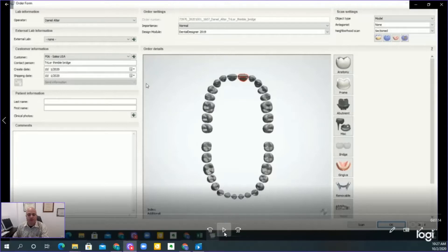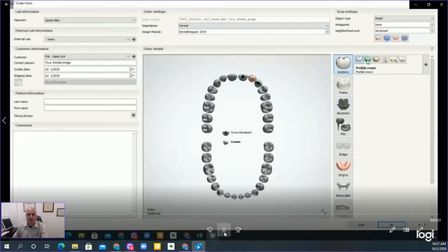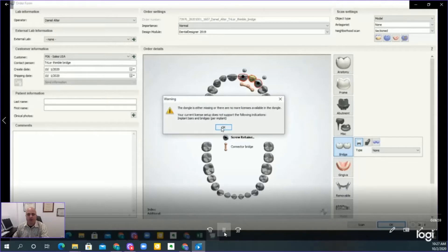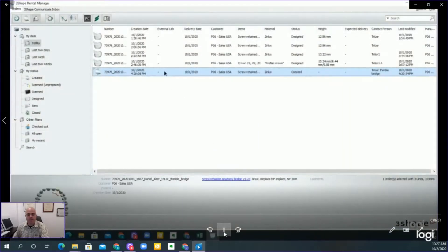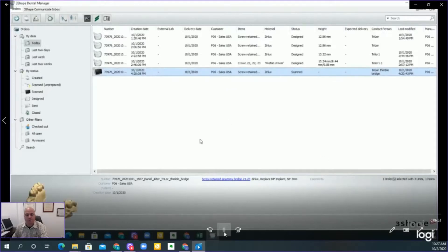There is now a Thimble library that you can import into your Three Shape. What you need to do is first create a full contour type — you select a screw-retain with a full contour within the library. You select the Pontic as well, which is again a full contour, full morphological.